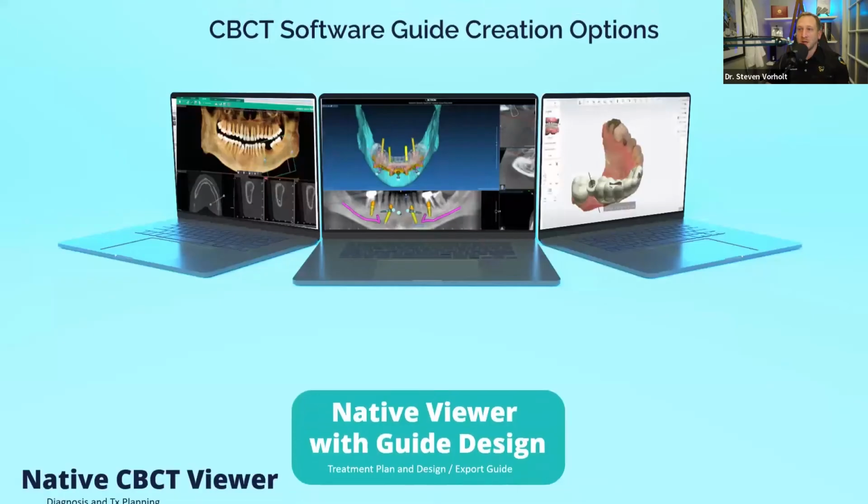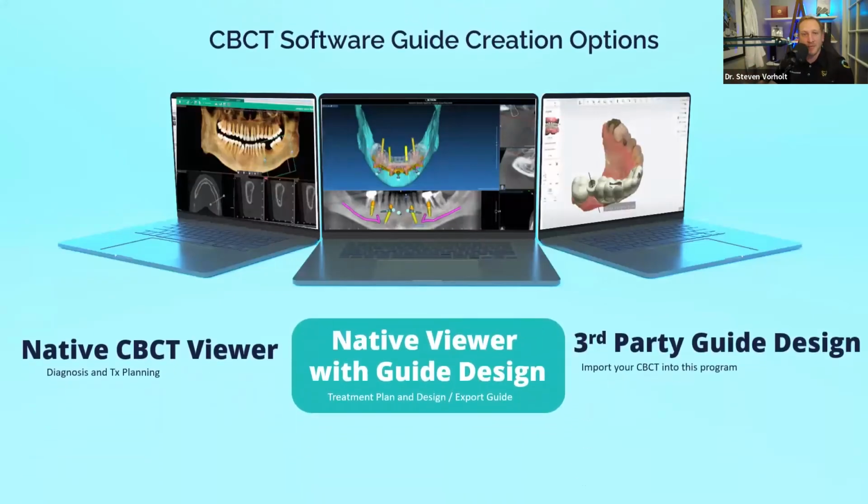Okay. So let's talk about some of these things. There's lots of different types of software. For the most part, there are some CTs that come with just a viewer. You can diagnose and do some treatment planning on these softwares.